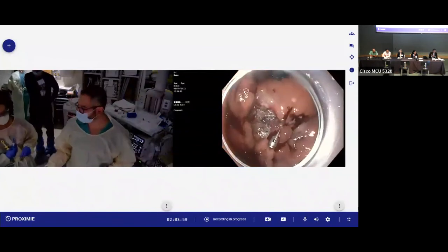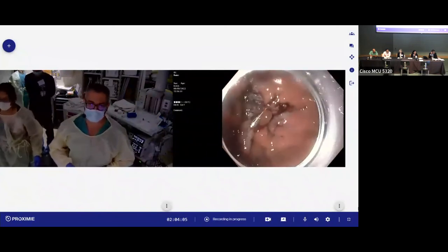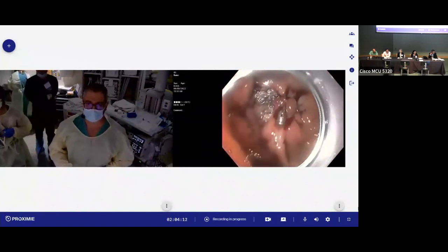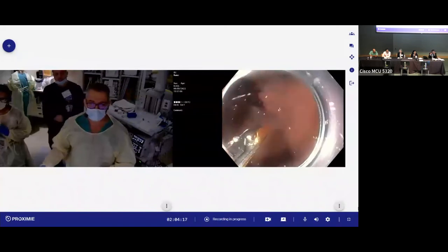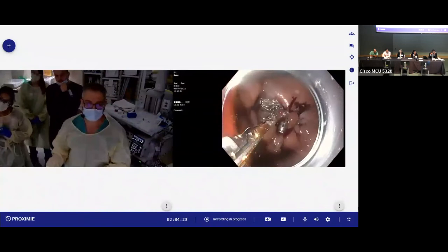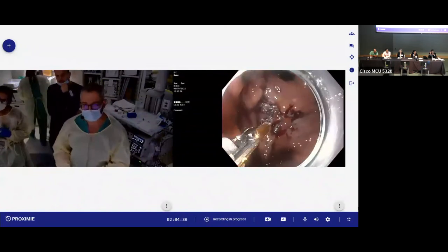Yes, so we give Levaquin, and we are also going to admit the patient for observation for 24 hours. And it's not because of perforation, it's for post-resection syndrome. We use a lot of cautery in a very sensitive area, and if he stays in the hospital and has IV fluid and antibiotic, he will have a better outcome than just sending him home, especially since he is from 4 hours away. It's so interesting that the patient here was referred from far away, where in this situation you really have to think twice before sending them home after a complex procedure.